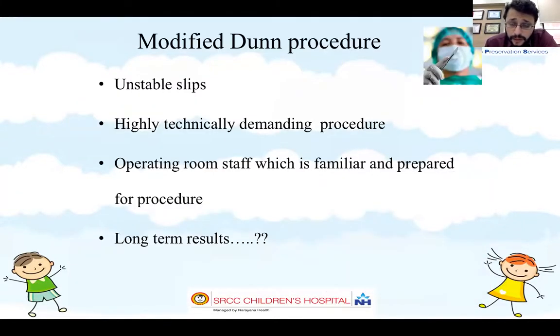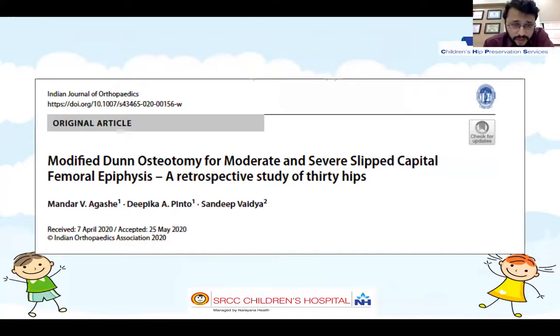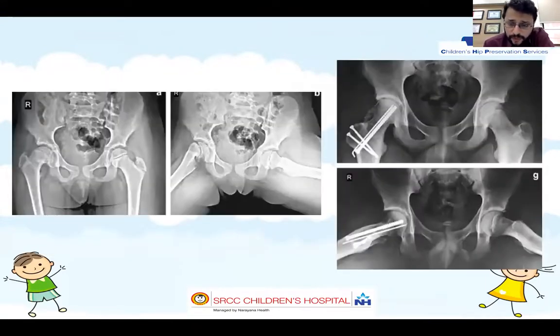It is an extremely technically demanding procedure. The operating room staff should be familiar with the procedure. You should be very careful in doing it in a stable slip, because whatever AVN is going to happen, it's going to happen because of your surgery in this case. And we were lucky that we were able to publish this article in the Indian Journal of Orthopedics, one of the first and largest series of modified Dunn osteotomy for severe slips. So this is one of the cases in that.